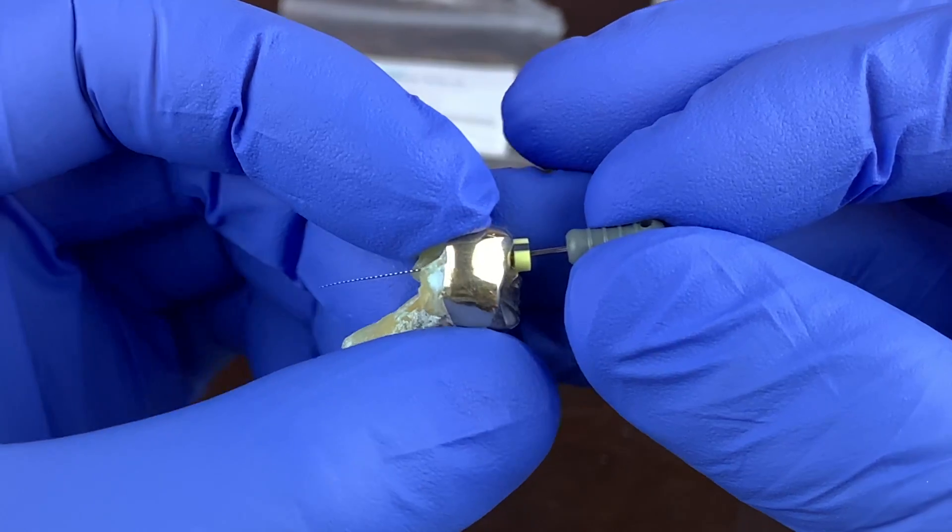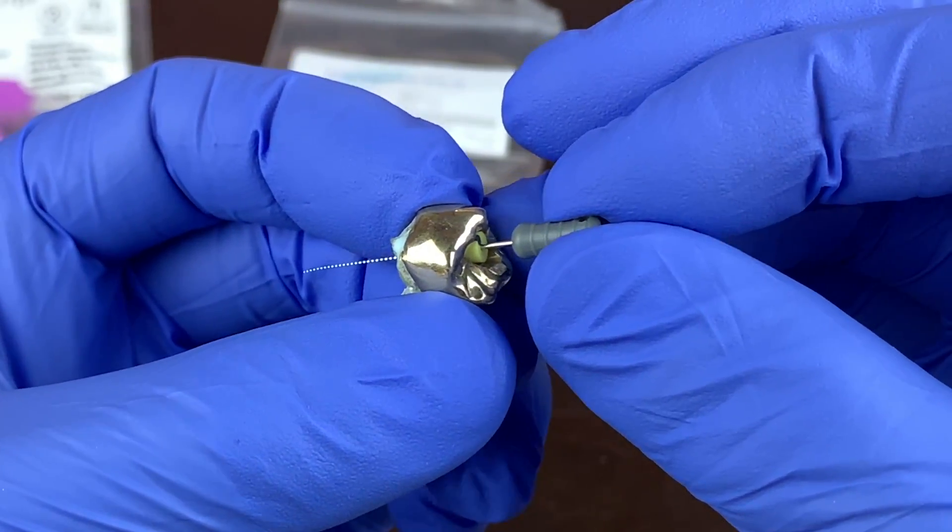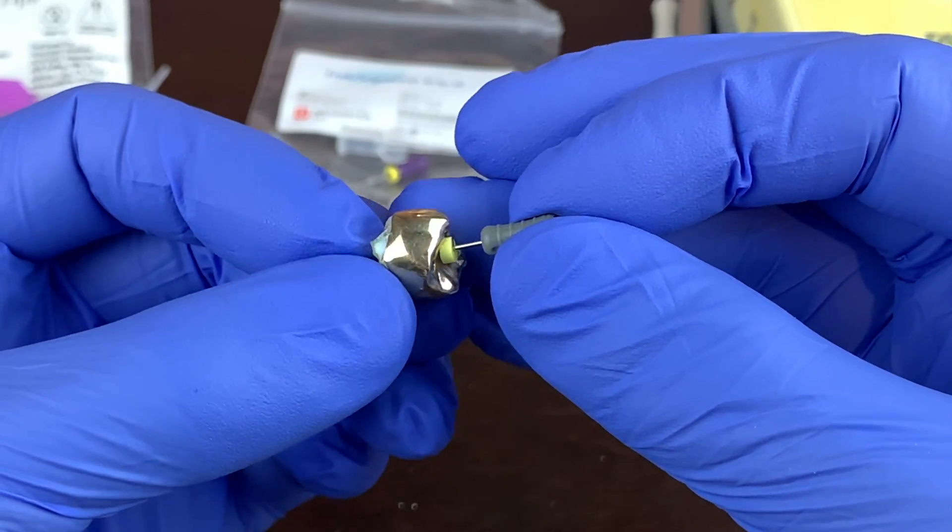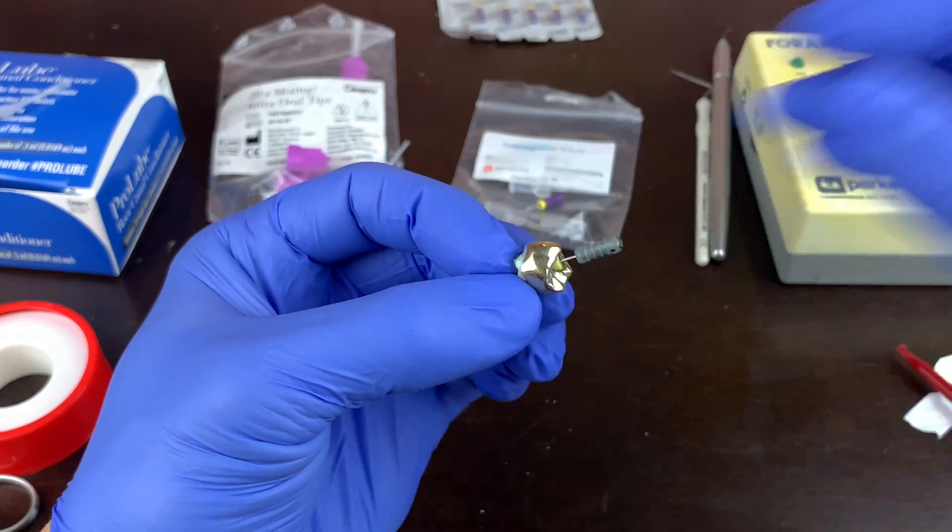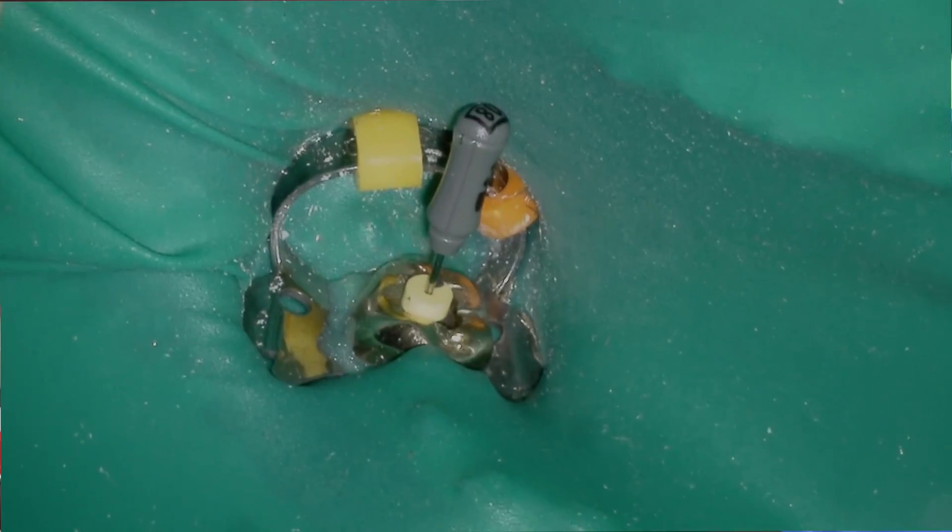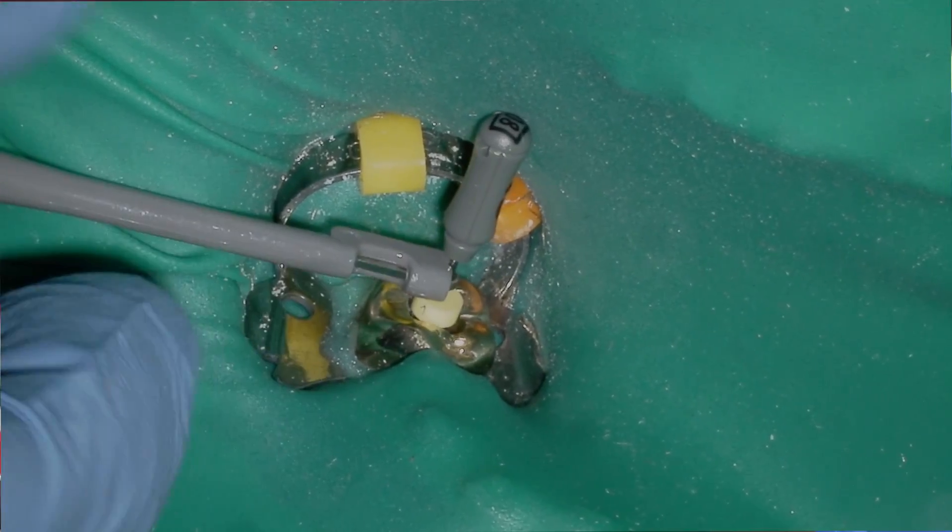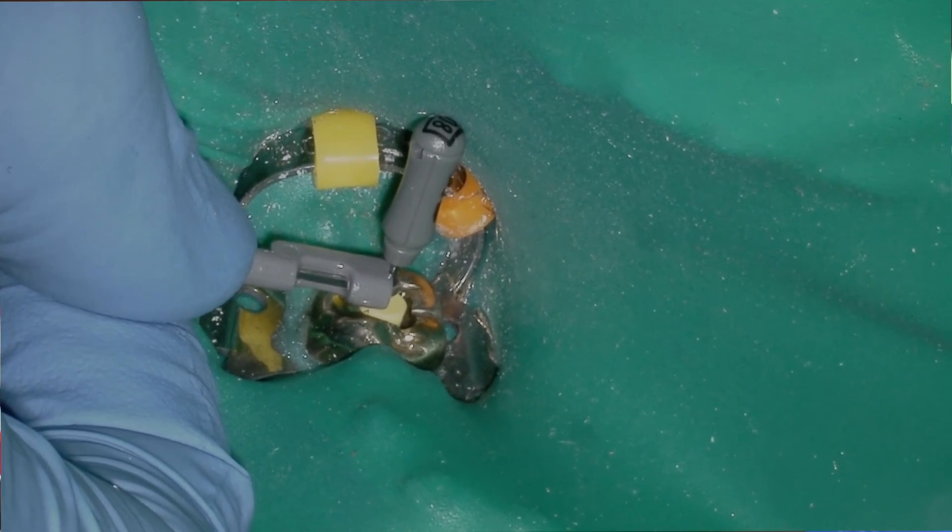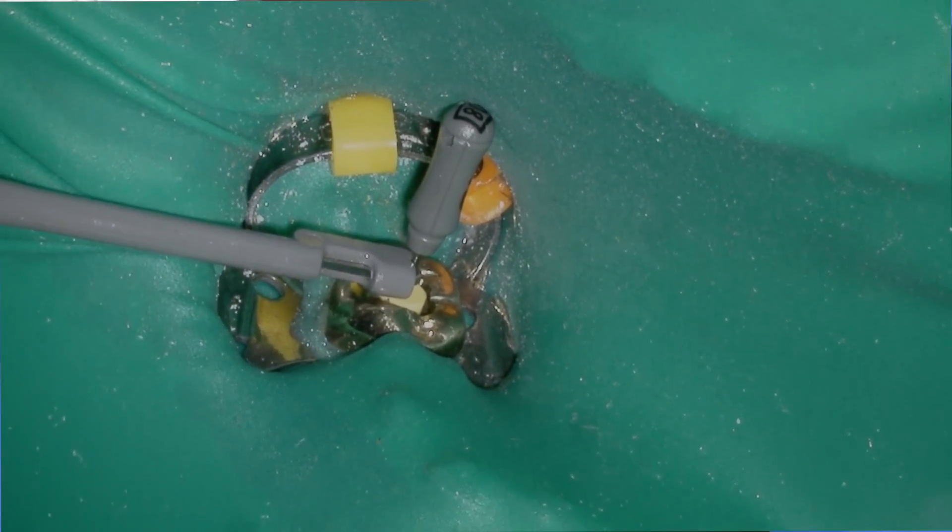Now, what you can do is actually hide the rubber stop in the internal aspect of the access and measure from the top part of it. So that's a simple technique where you don't have to have any special tools, just a file and a root canal. And there you go. So you can take your working length from the top of that and place your file to length.